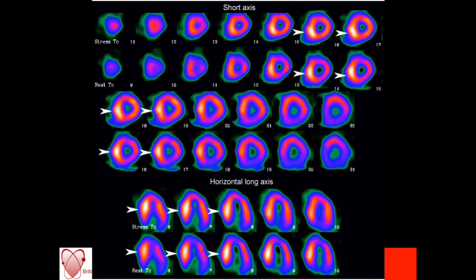Again, staying with the septum, the other condition also probably quite common is hypertrophic cardiomyopathy, and the relative hypertrophy of the septum causes a relative hotspot compared to the rest of the heart. You can see the difference here in the uptake between the septum and the lateral wall, and it might cause adjacent relative reductions due to that relative hotspot. But you can recognise the morphology and identify that for simply there's more muscle mass, therefore there's more myocytes, therefore there's more uptake from the perfusion tracer.